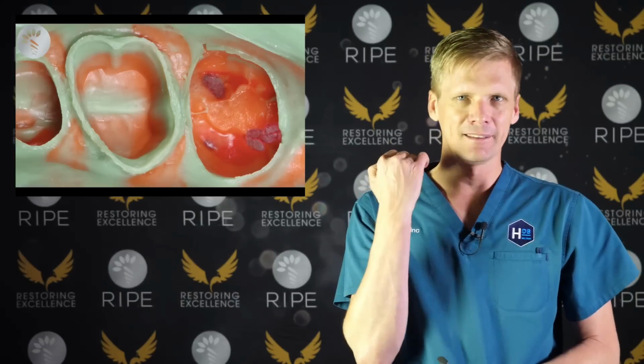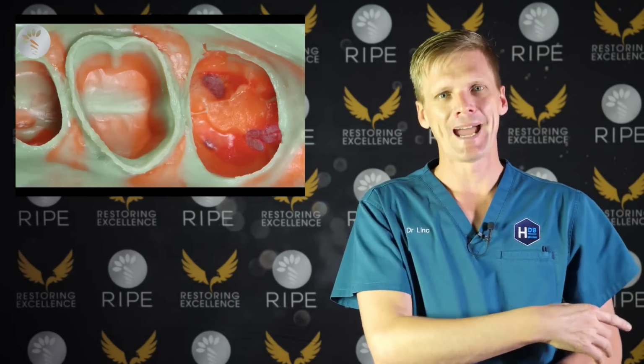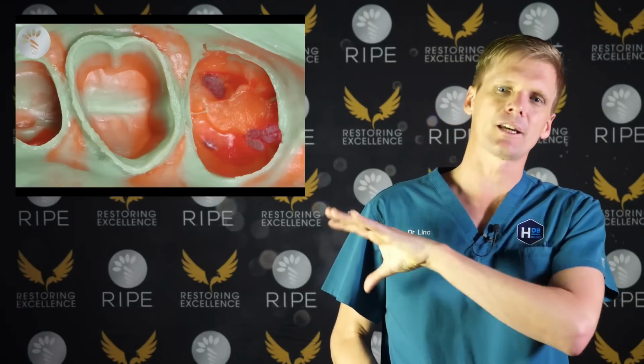If you're doing 10 teeth, then it's a bit trickier because you need to start pulling the cords out before you start filling the tray. And that's when you need to leave the cord for quite a long time so that you can pull it out 10 minutes before you get to the impression. Well, not that long, but it would take a couple of minutes to pull all the cords out gently. If you pull them out too quickly, it's going to bleed.